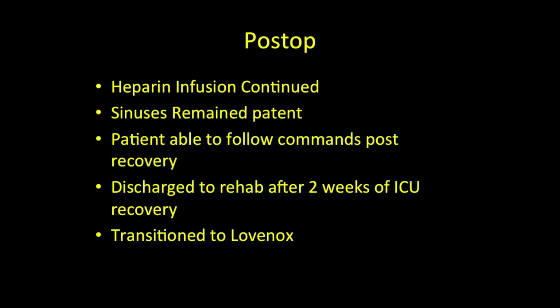So this kind of summarizes the different therapies available for endovascular mechanical thrombectomy for venous sinuses in the setting of venous sinus thrombosis.